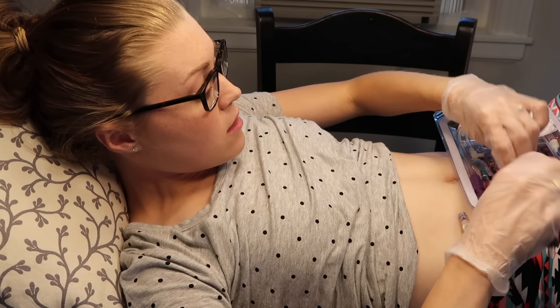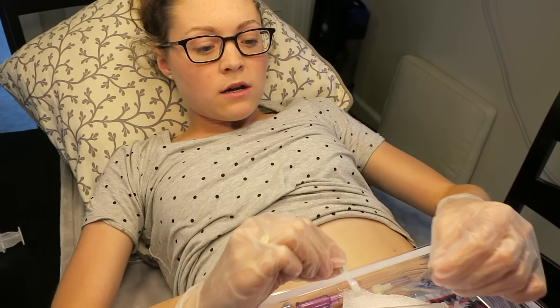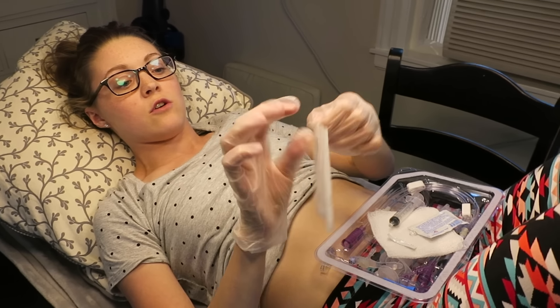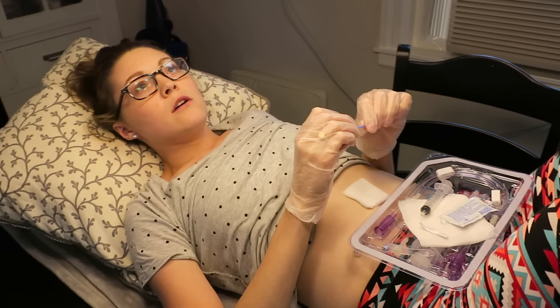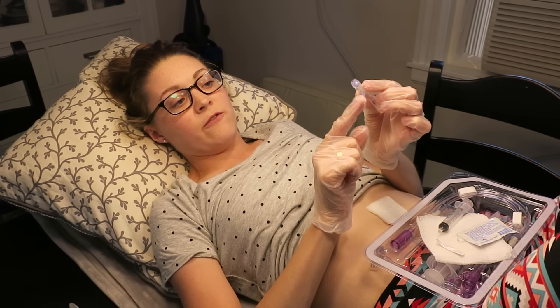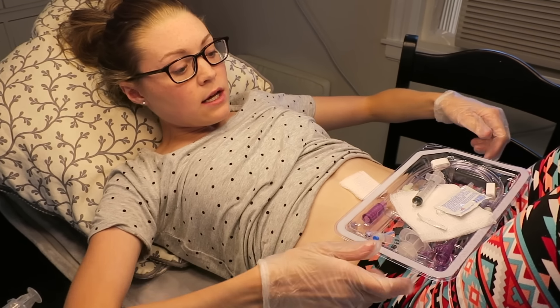I'm going to set the button back in the tray and go ahead and open up this jelly packet because that's what I'm going to need once the button's out of me. I'm going to put a little bit onto this gauze so that I don't have to be fooling around with it. I'm going to have this gauze ready for my hole because it might leak a little bit. And I'm going to put the — what did they call it — the guide. The blue part is stiff so that when I'm putting it into my stoma it just slides right in.